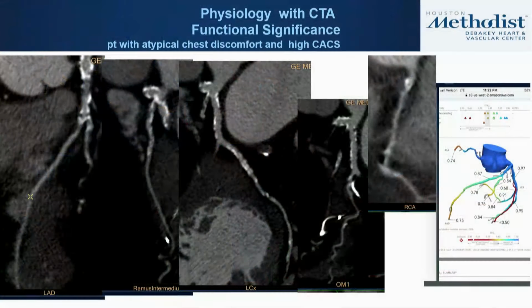So the bottom line is this: we do everything we can with calcium in terms of making sure there's no motion, coronary motion due to heart rate or patient motion for that matter, and also using sharp filters to try to eliminate some of the blooming artifacts that we see. But there are certain patients that are totally uninterpretable. But you can see this case, fortunately, most of the coronary calcifications are eccentric.